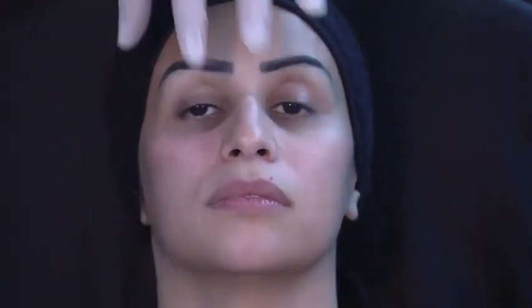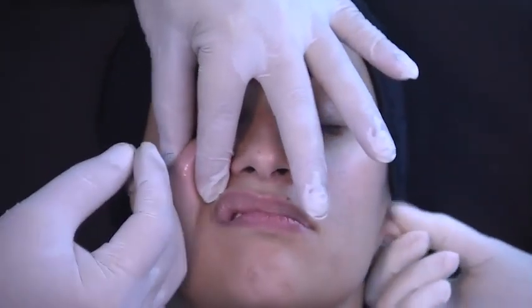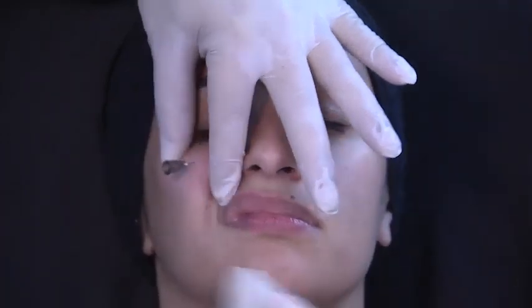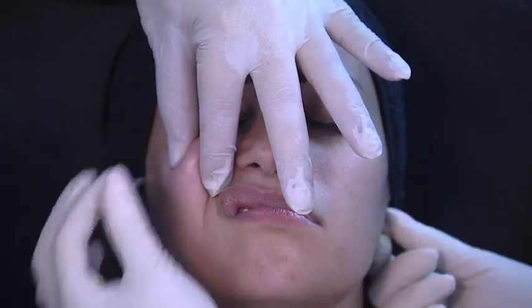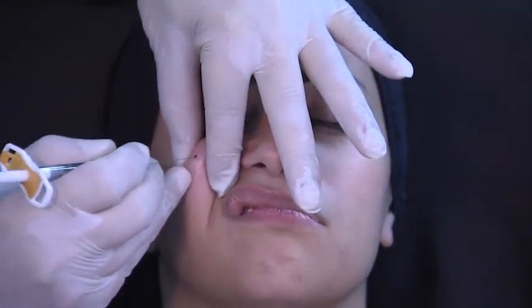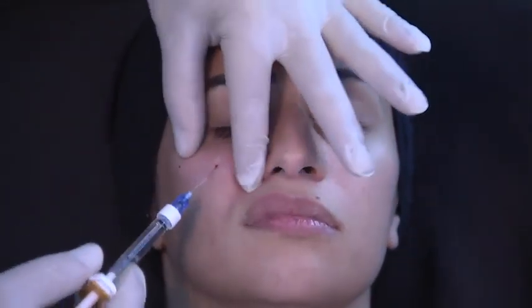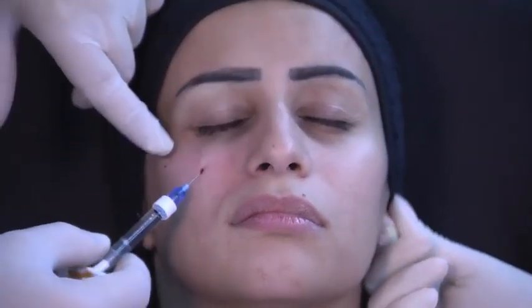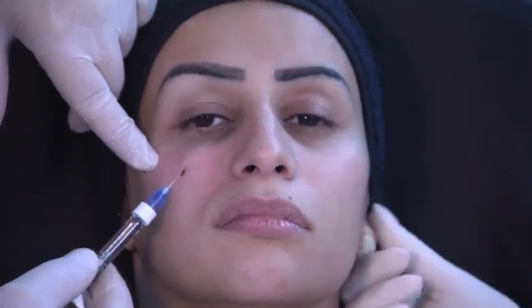So I'm going to go to my entry point, pinching the skin. My entry point is just a little bit with the needle. I always try just a little bit. It's a 27G needle. I hold my syringe like a dart to be stable and I get in. Look how easy it is to get in with the same size. Now I'm going to pinch the skin to make sure that I reach the bone. So now I know if I try to elevate my cannula, I don't see the cannula.